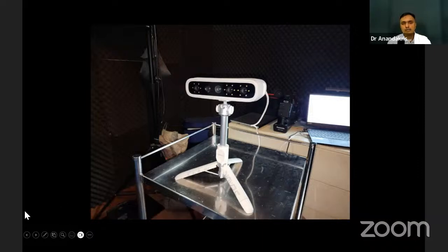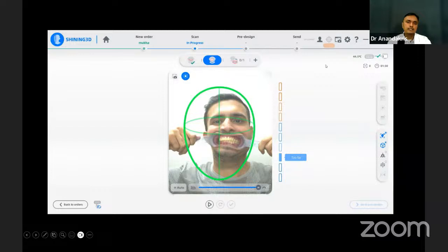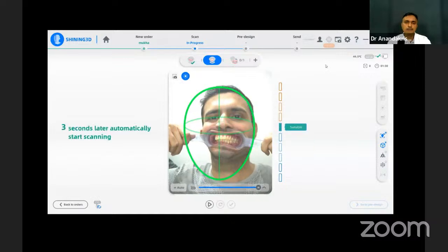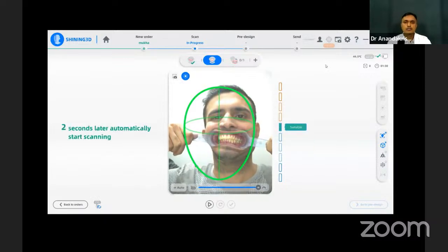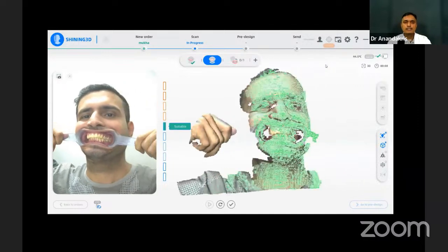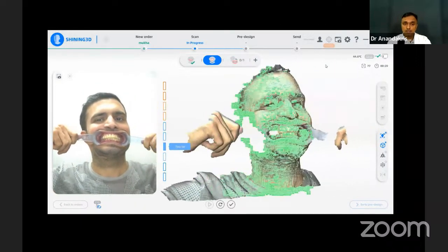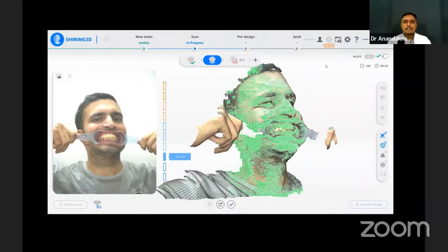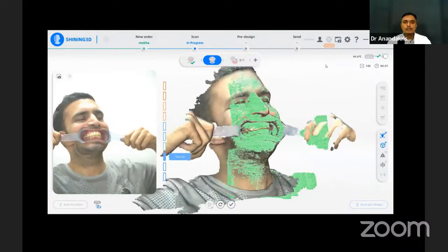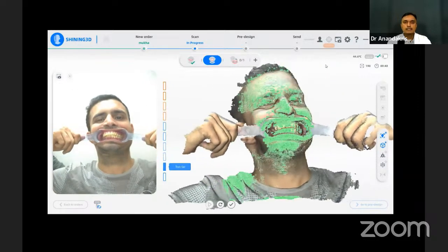We had not worked with this technology, but if you see here today, this is the facial scanner. You can see that this patient has some kind of hemifacial microsomia, some facial deformity. We want to bring it in because it involves the teeth, the face, the plane of occlusion, the aesthetic plane, and also some part of the nose. So we want to see if we can do some kind of modifications, where now we are doing the facial scan with the retracted pose.